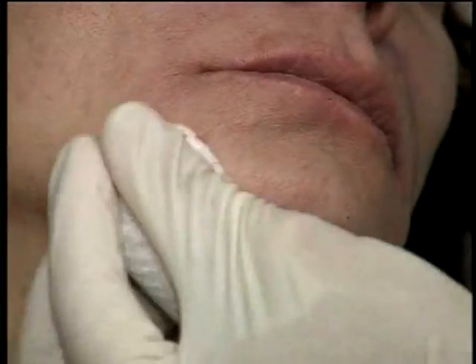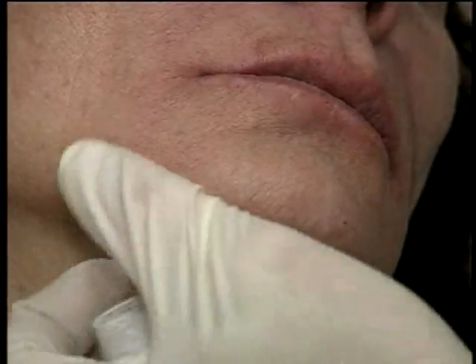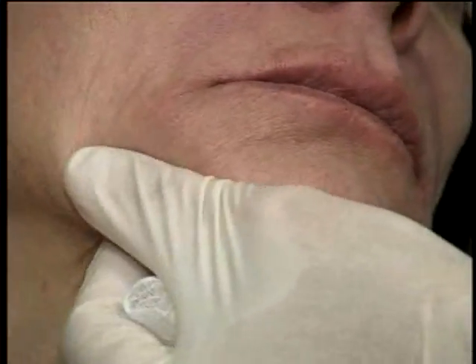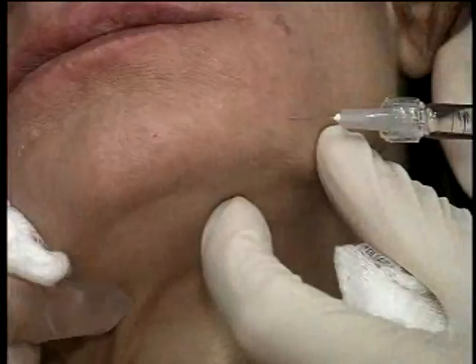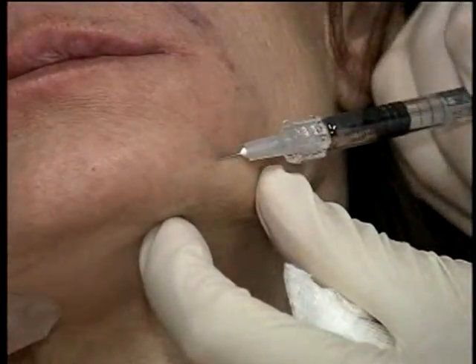So massage it into place. Okay, so I think that's appropriate. That looks like it's filled to completion. Now we'll do the opposite side so that we have a symmetric response. And I can see that area right there.